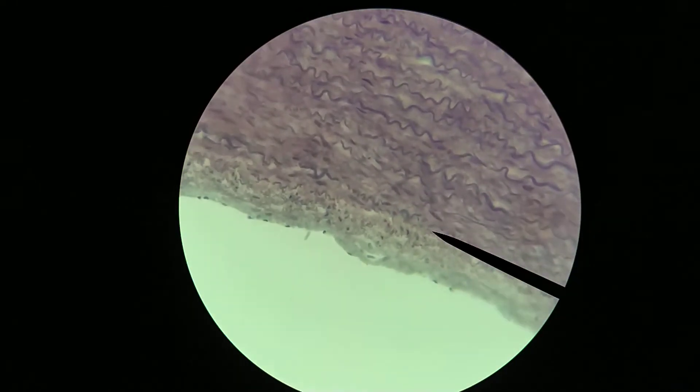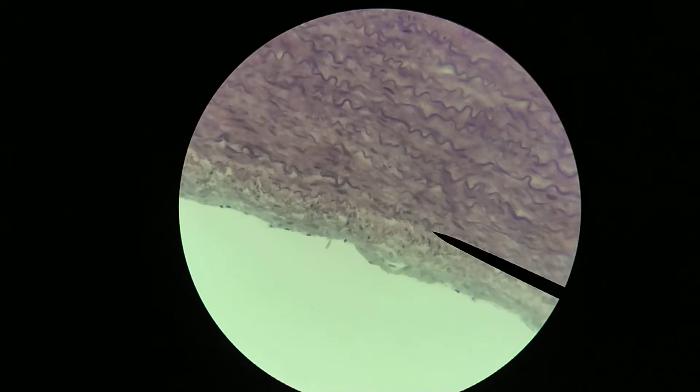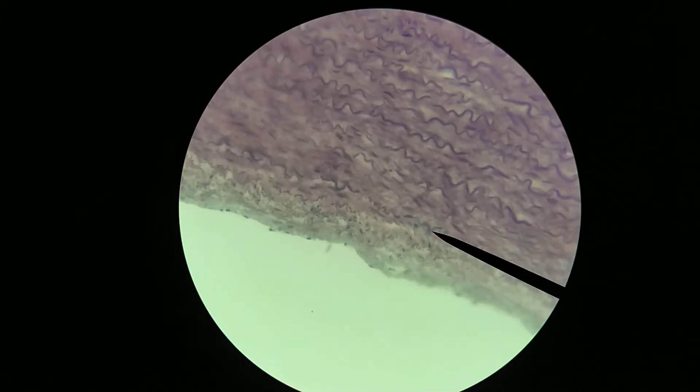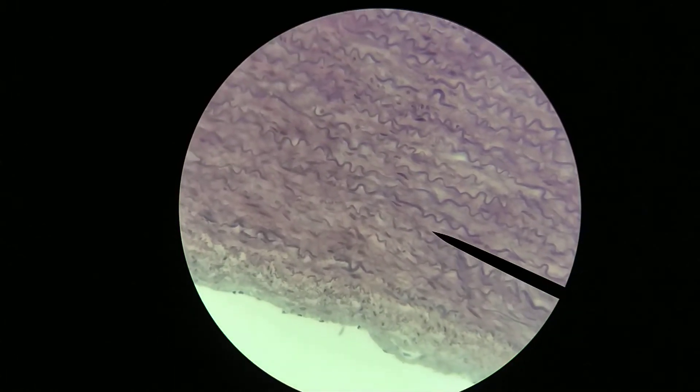And then we start to notice kind of a fairly intensely stained, wavy band right here. So this right here is that internal elastic membrane. And you'll notice the same sort of pattern repeating as we go deeper and deeper into the blood vessel.